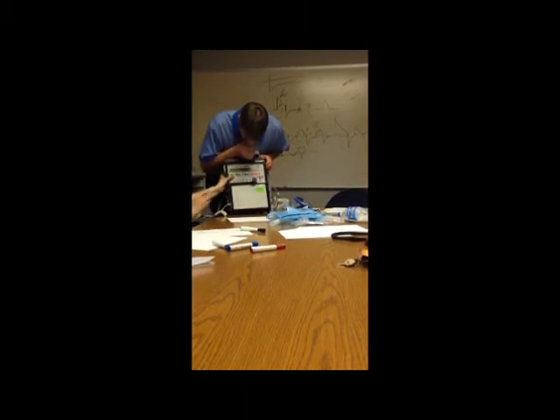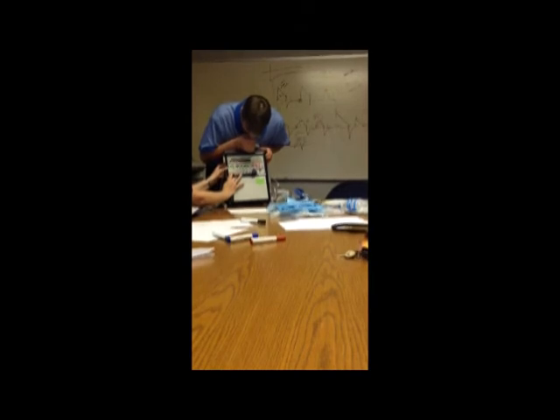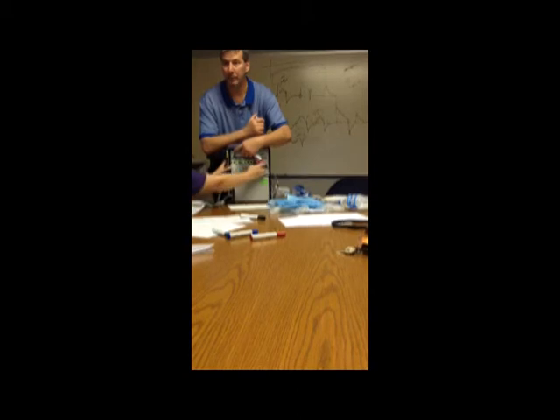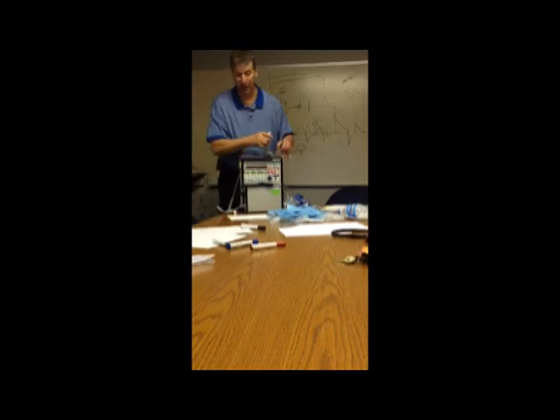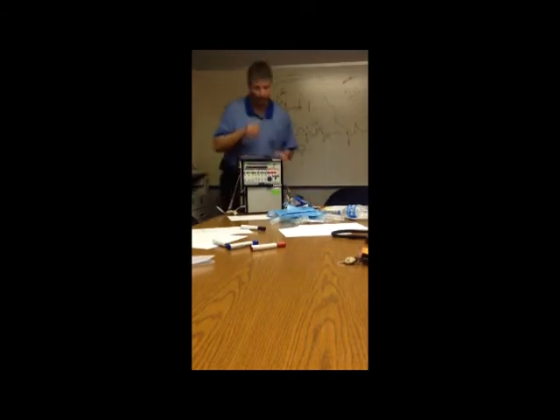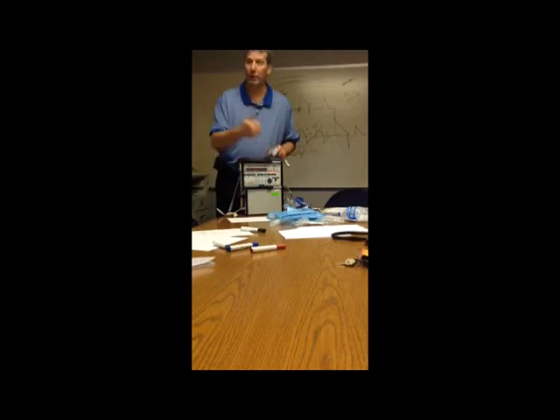Right there? You see how that went negative? How the pressure went negative? It went from the 0 over that way. That was an extreme version of me sucking in faster than it's blowing out, okay?